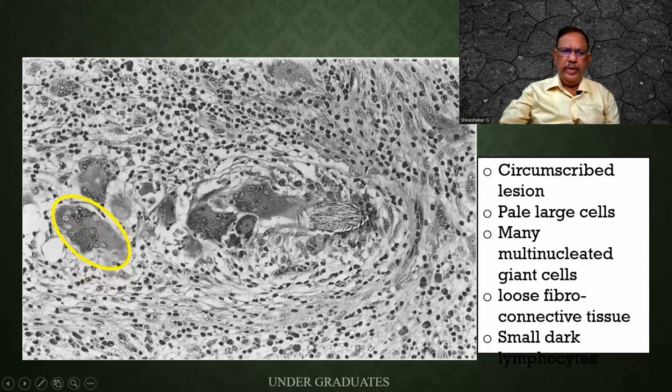Look at this picture over here. So there is a giant cell, multiple nuclei are there, and there is some whitish or refractile material within, which I would like to call a foreign body. If this is not convincing enough, let us have a look at this one. The blue line, within which I am finding an amorphous material with some kind of striations. It is probably a suture material or some other foreign body that has been left behind in the tissue.